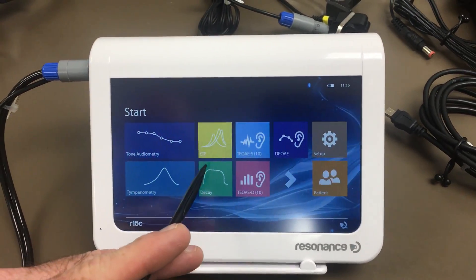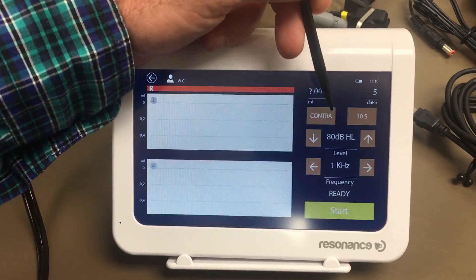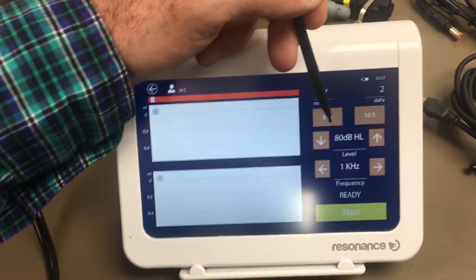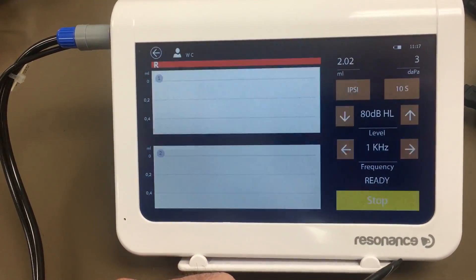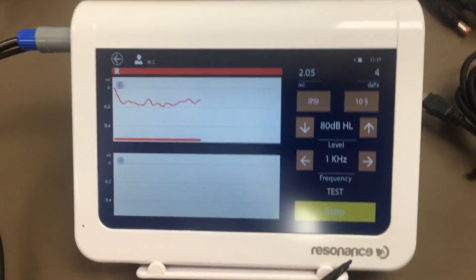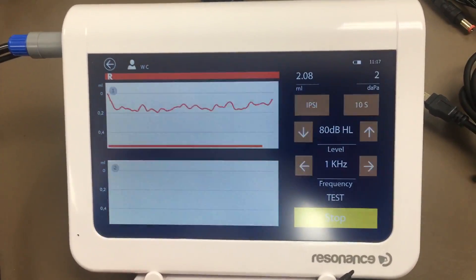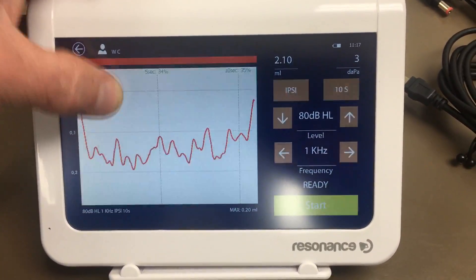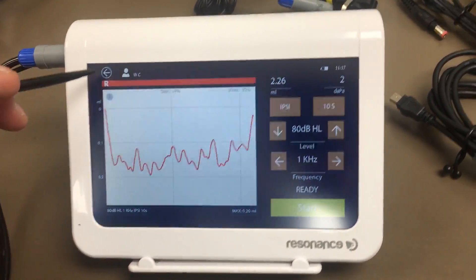The last test we're going to cover is decay. You hit decay and can change whether you need ipsi or contra, your time — 10 seconds or 20 seconds — and your dB and Hz level. Then just hit start. Once it's done, hold the button down for six seconds on the main screen and it will give you your test results.